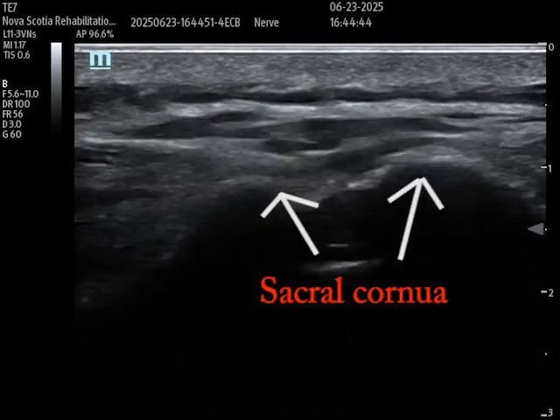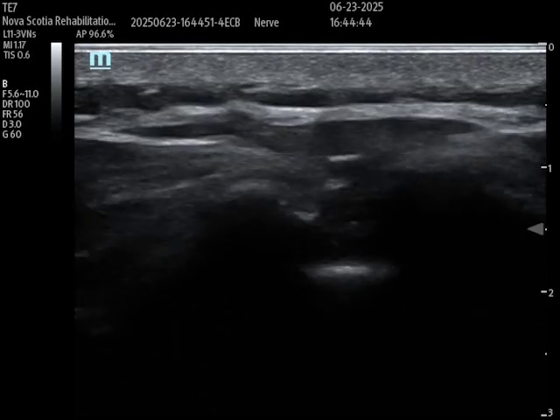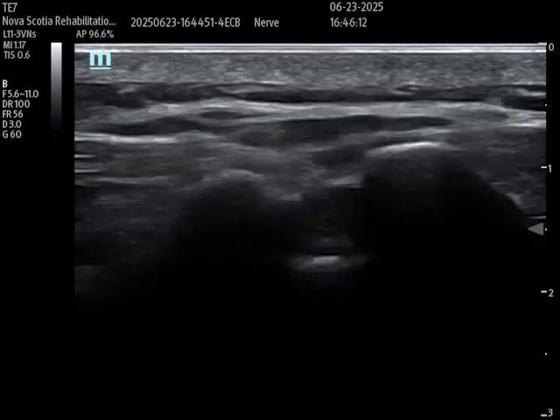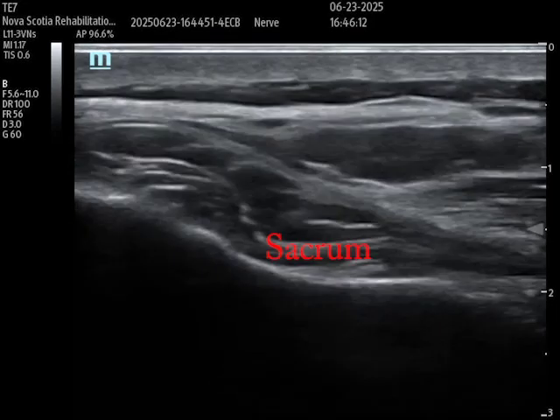I'm going to stop here — and there are the sacral horns, or the sacral cornua. I'm now really at the inferior aspect of the sacrum. Restarting the clip: here's the sacral cornua, and then I'm translating that probe laterally at the same level. And there is my sacrum.